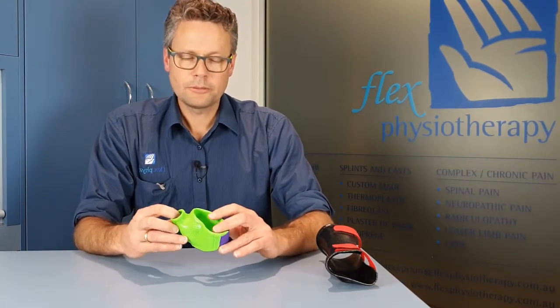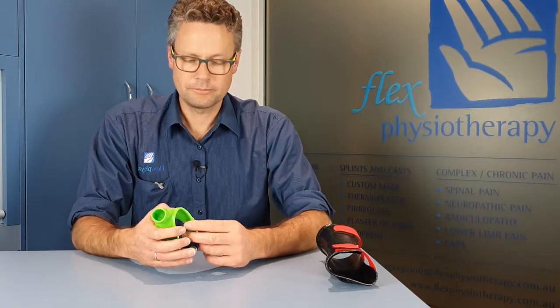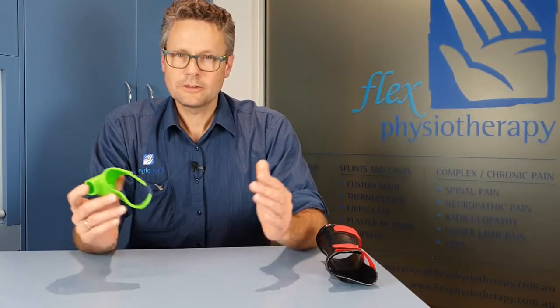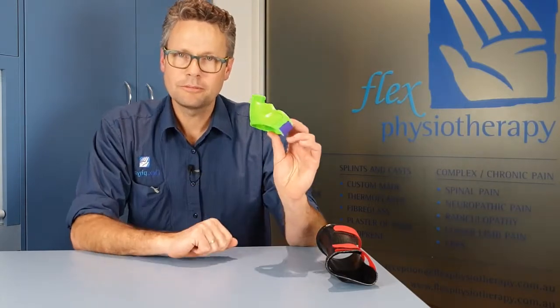But if you've never seen one being made or had one made on you, then the process might be a little mysterious. We could show you the whole process from beginning to end, but it would take a 15 to 20 minute video to take you through it step by step. So what we've done here is to condense all of that into a very short one to two minute time-lapse video showing me making one of these thumb spica splints.